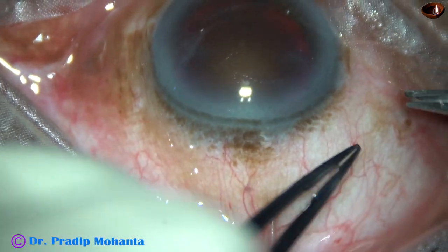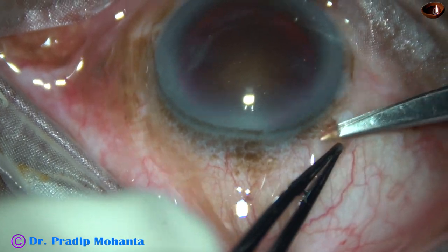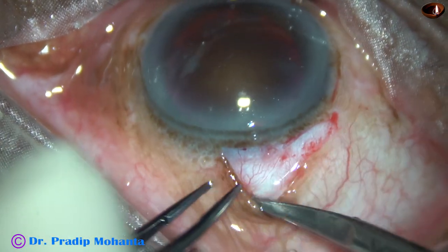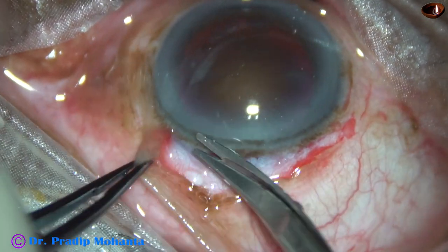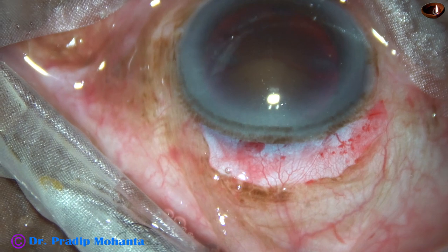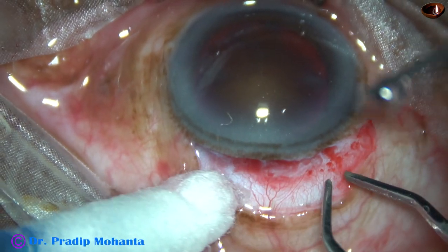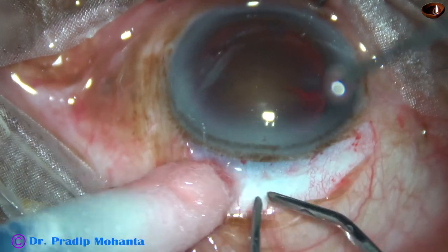First, Conjunctival Peritomy. A Westcott scissor is taken and peritomy is done for about 3 clock hours from 10 o'clock to 1 o'clock. This much peritomy is okay. And now very mild wet-field cautery is done. We can do surgery without cautery but there is no harm in doing mild cautery.